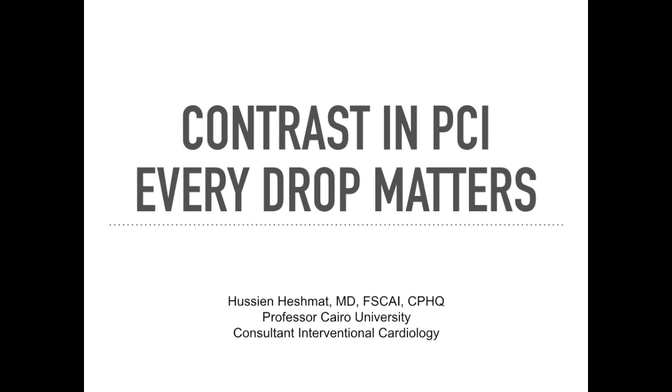Hi everyone, this is Hossein Heshmat, interventional cardiologist, and in this video we'll be discussing contrast in PCI, how to reduce the dose of contrast to avoid contrast-induced nephropathy, and we'll go through a quick case vignette.